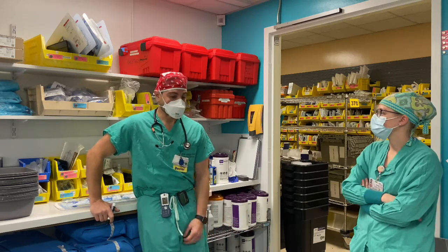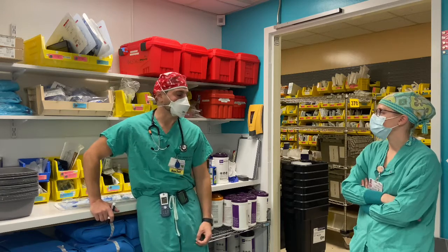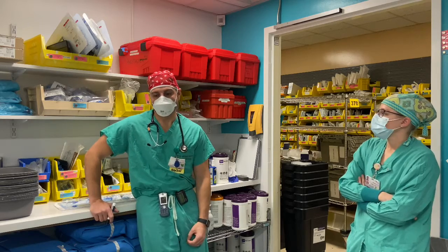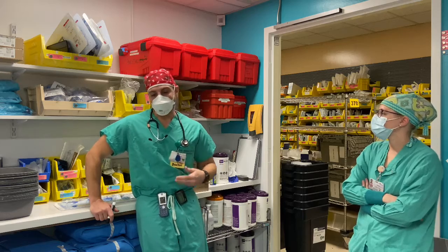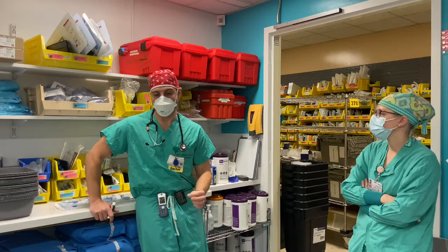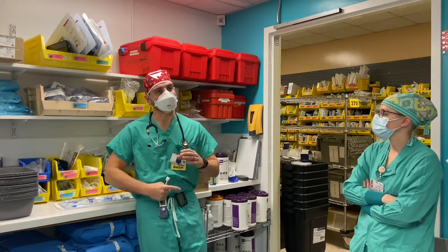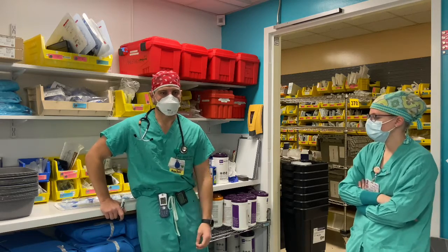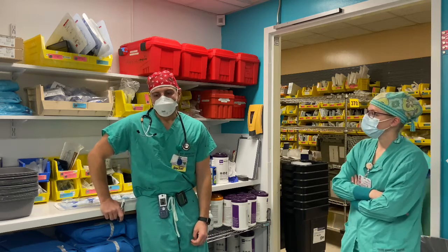Another reason to intubate somebody would be to protect against the air or other body fluids going in the wrong spot. What I mean by that is if somebody's got a full stomach, or a lot of acid reflux, and we don't want stomach acid or stomach content to go in the wrong direction, meaning into the airway, we'll put an endotracheal tube down, because that cuff, although it's not 100% protective, can minimize you aspirating something from your stomach into your airway. So that's probably another real good reason to put an endotracheal tube as opposed to an LMA.